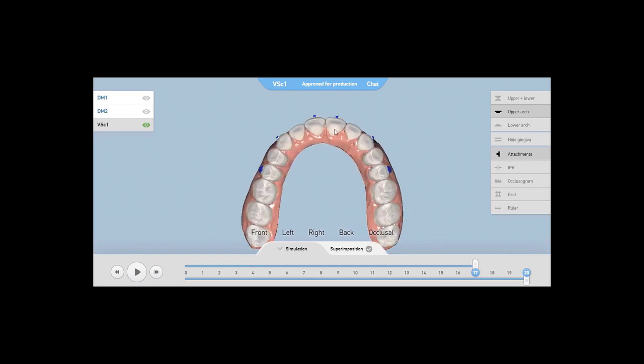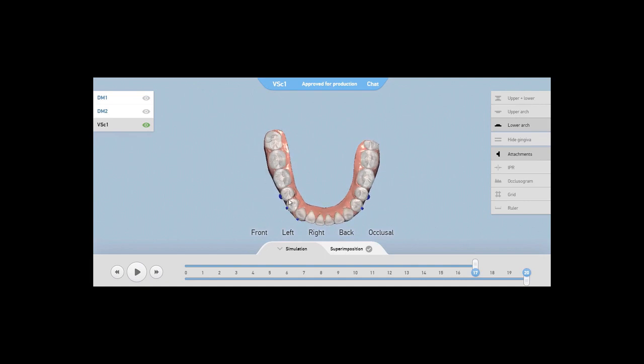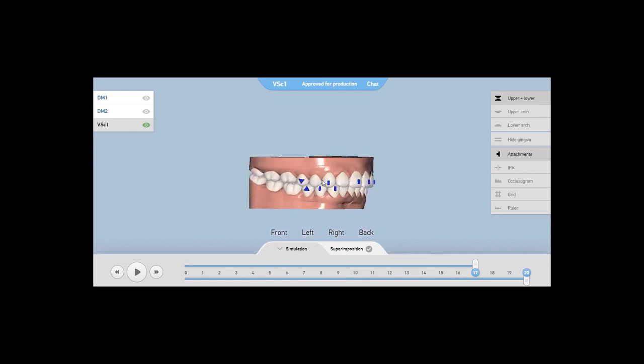One thing to remember is that we strongly recommend using a fixed retainer after treating diastemas and tremas, as it ensures constant teeth position control. Because when you use a clear plastic retainer only at night, for example, the teeth might move a little during the day, thus creating an unwanted movement. The teeth will be in small but constant movement without maintaining a stable position. The same thing is recommended for the lowers as well.